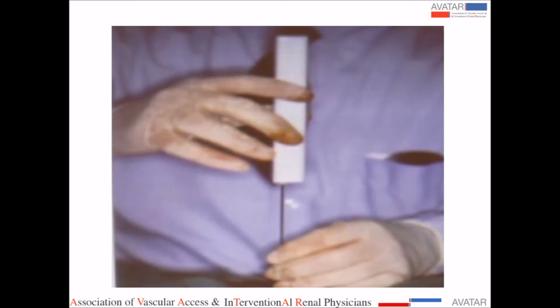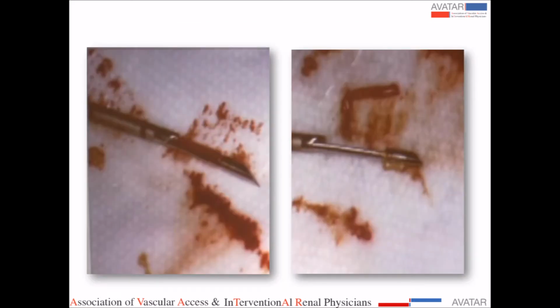And then once you're sure you're in the kidney, you're in the right place, take your biopsy needle, and you can get, as you see, really nice cores. You can even see some of the gloms to the naked eye. So that is how you do a kidney biopsy. I'm not going to go over the indications and the contraindications. We all know that. This is just the ultrasound portion of the talk.